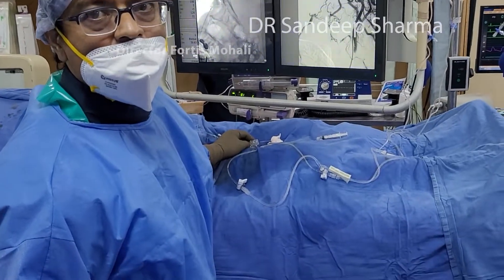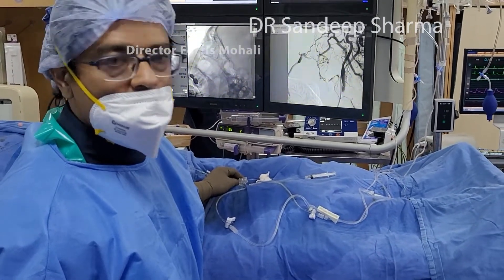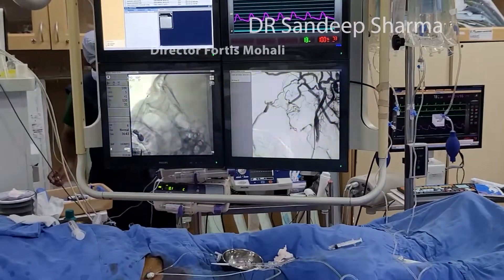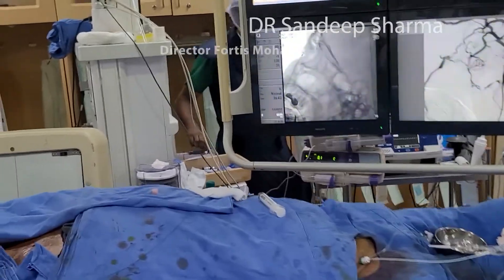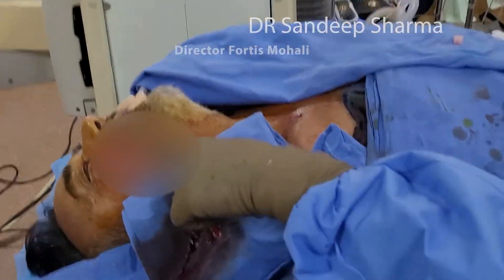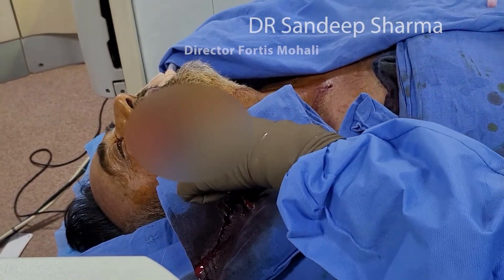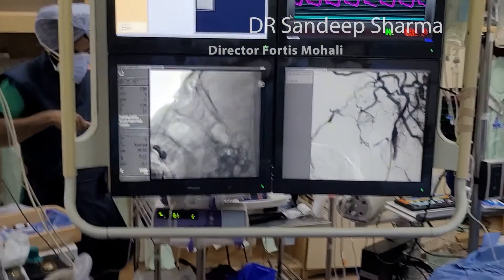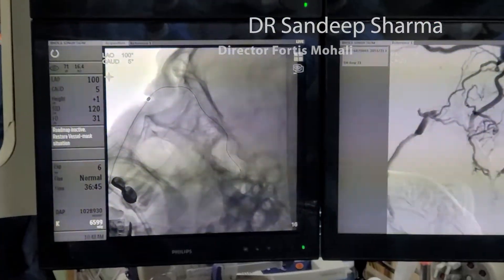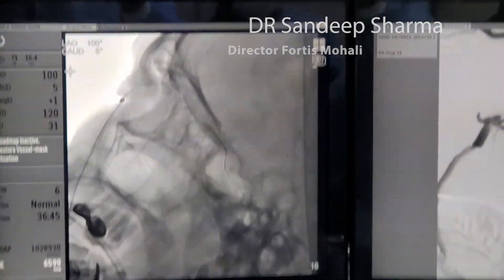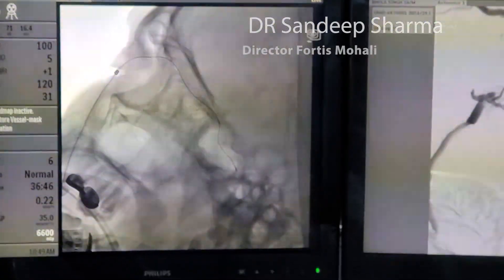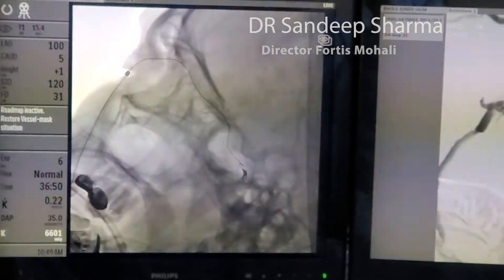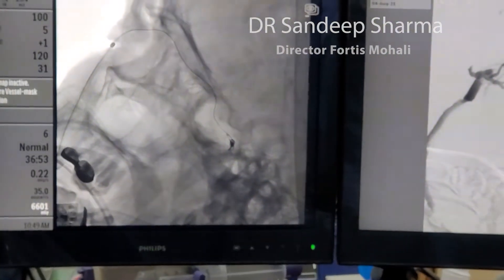Now I take a micro catheter. The superior ophthalmic vein is not filling well at this moment. I have the sheath in the facial vein up to the angular vein, and now the micro catheter is through it. You can see this is the lateral view. We now have a coil reaching into the cavernous sinus, lateral to the sella — in fact posterolateral.